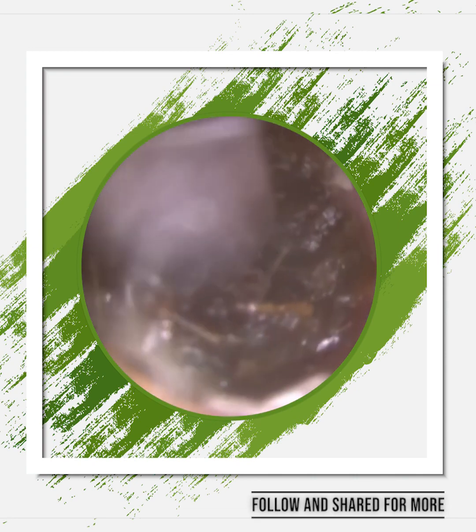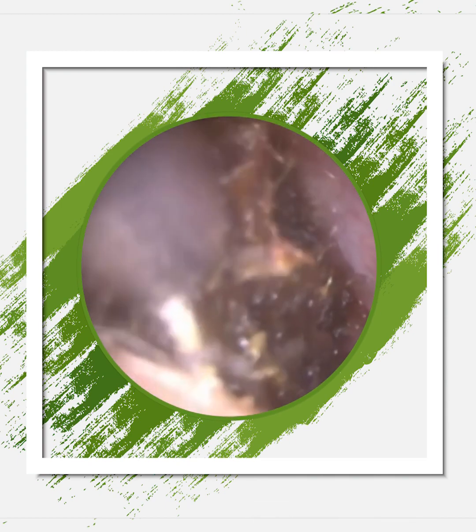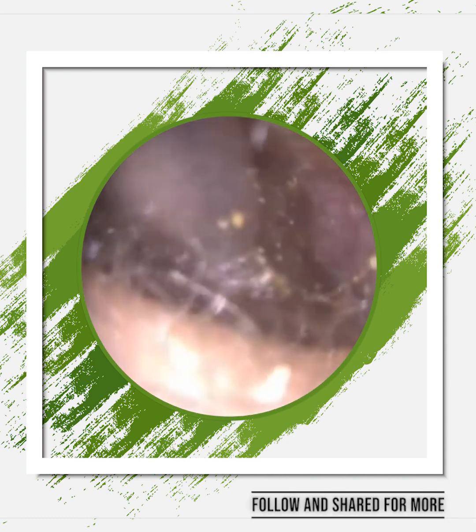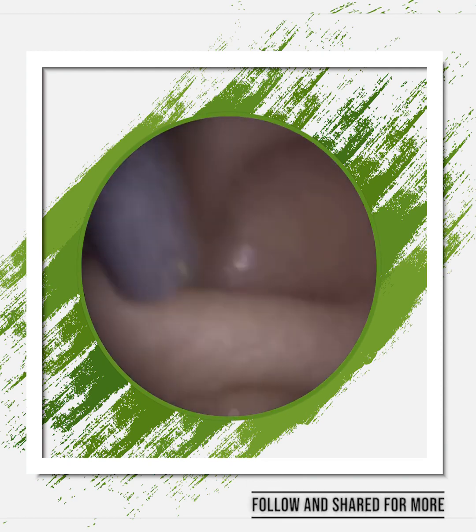See, we're making very good progress now. I think this is the final plug of wax and keratin. You also can tell that the wax and keratin's been there for a while because it's oxidized. Fresh earwax is usually a light brown shade. Fresh dead skin is actually white, and over time the dead skin and wax oxidizes and it turns into a darker shade of brown, and eventually it can also turn into a completely black appearance. And you know, if it's black, it's been there for a long time. So I've managed to extract this plug of wax out of the second narrowing, the second isthmus, which is around 0.5 centimetre away from the eardrum.